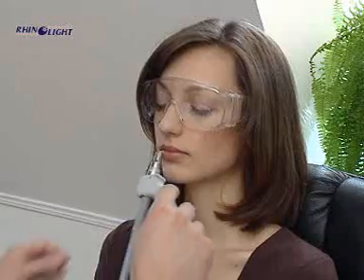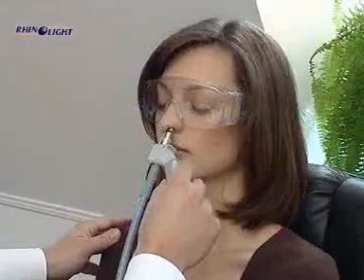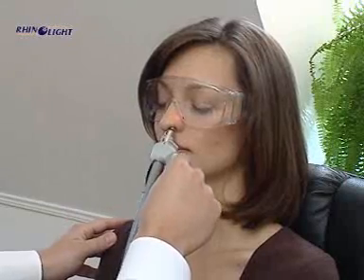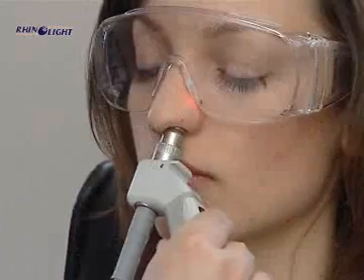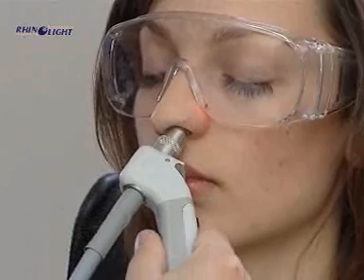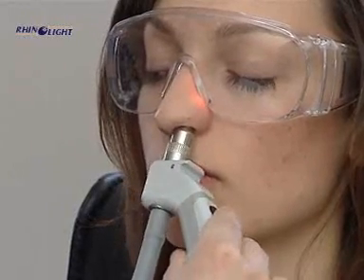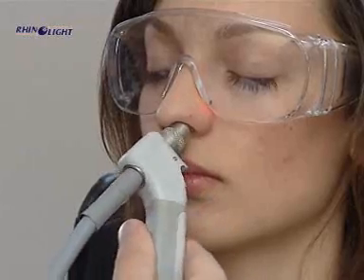The nasal attachment is placed in the patient's nostril with the help of the treating head, and the treatment is started with the start button on the treating head. During the treatment, the nasal cavity is continuously panned with circling movements using the treating head. The patient doesn't feel either pain or heat. The aim is to expose to the light as much of the surface of the nasal cavity as possible.